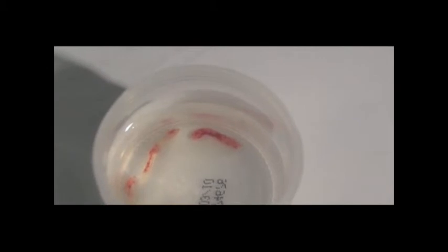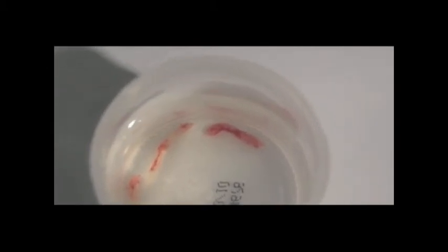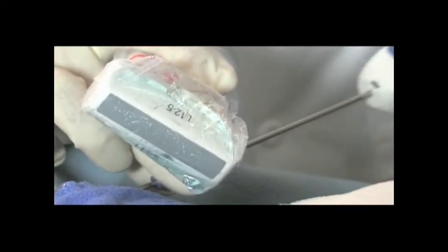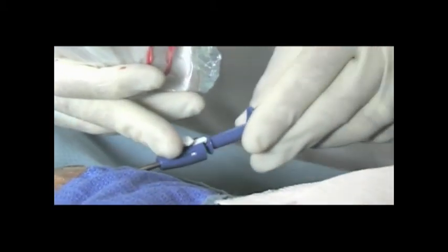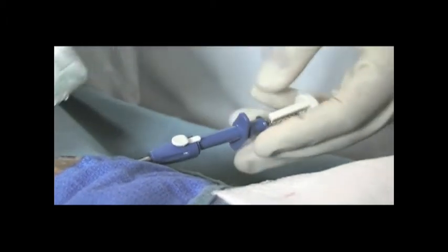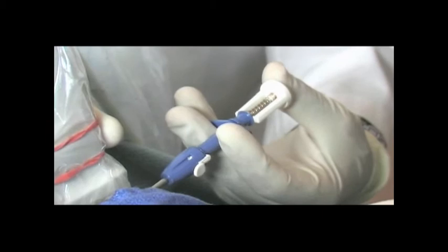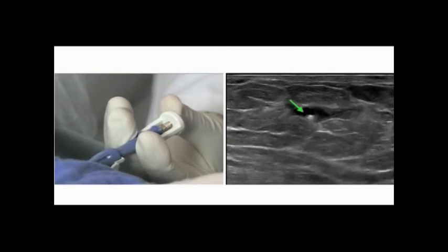Repeat the previous steps to perform the biopsy. In most cases, only two to three tissue samples are needed for an accurate pathology diagnosis. Once you have retrieved the tissue samples, remove the Solero from the breast through the introducer sheath, leaving the sheath in place to insert the biopsy site identifier. Insert the Solero mark through the introducer sheath; you will feel the deployment device lock onto the introducer sheath hub.